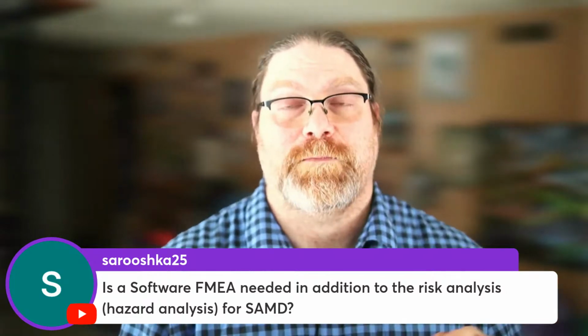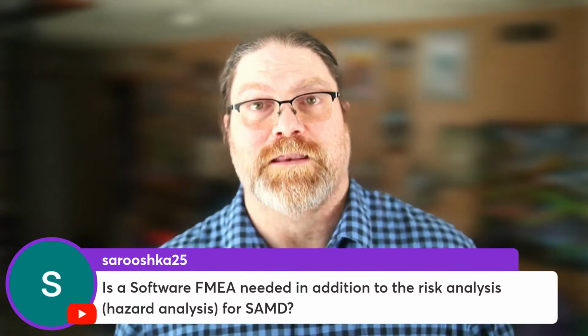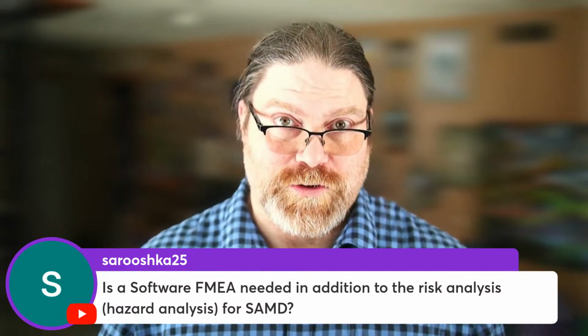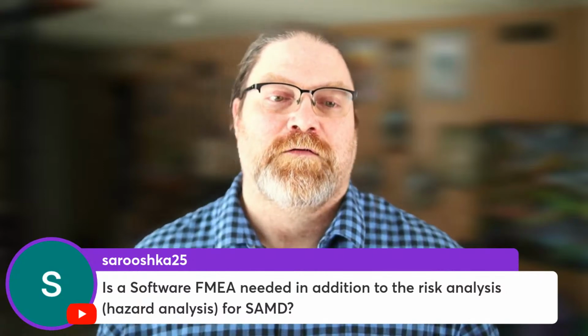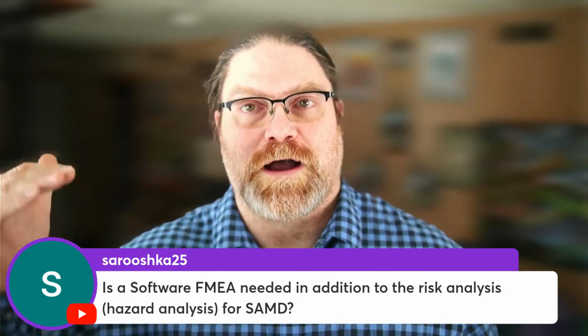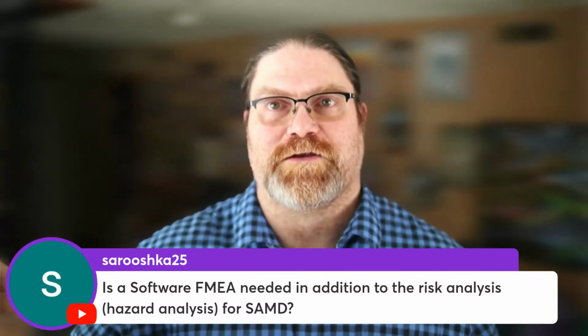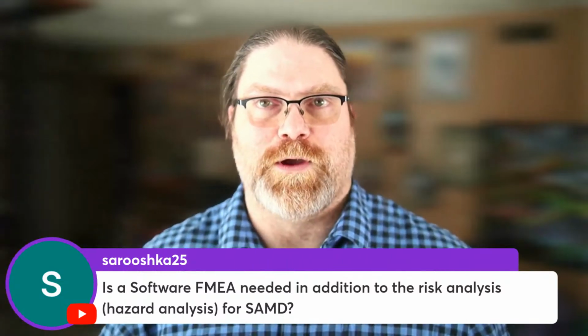FMEA is one of them. It's not the only one. If you look at 80002-1, that has examples in there too. So follow them. But the fault tree is usually the better choice for things that are software. It's also a top-down approach. So if you have a complaint, it becomes easier to figure out, well, what caused this? So you start at the top and work your way down.